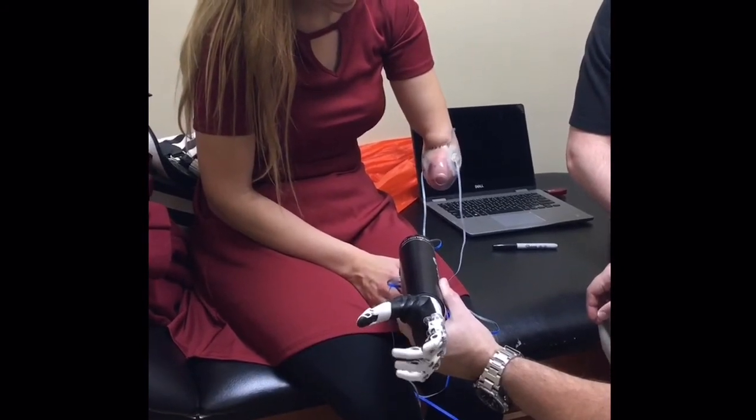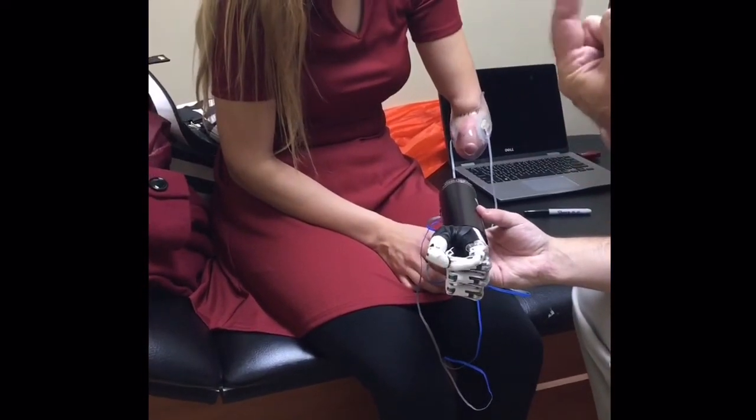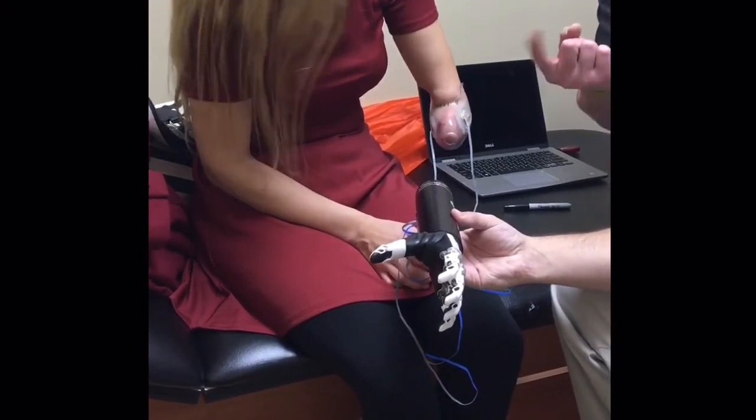So now when you close that fully, you can waggle open and close to make that finger go back and forth. That's like when you have a student misbehaving and you just look at them.